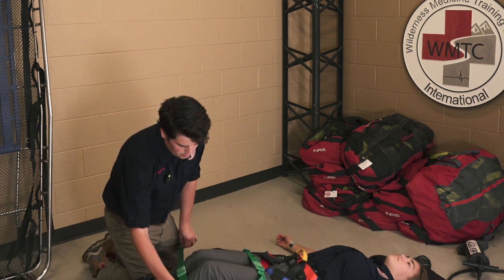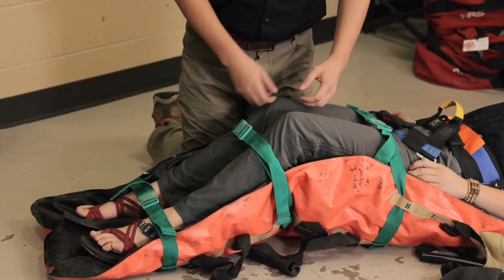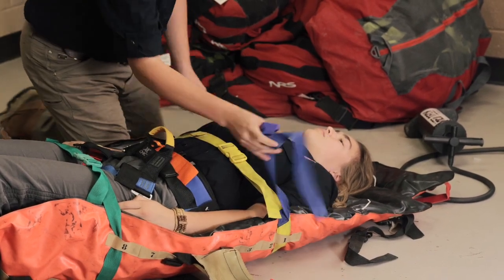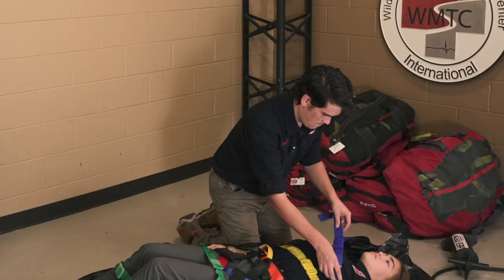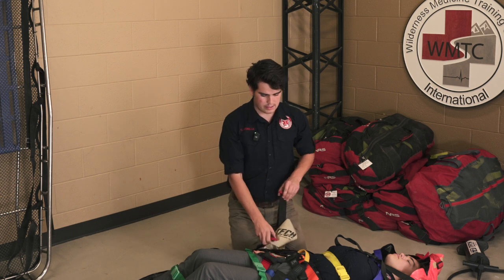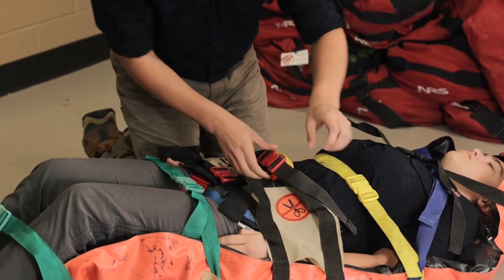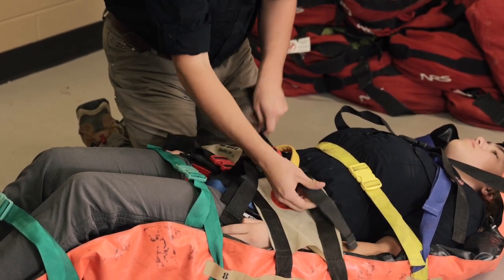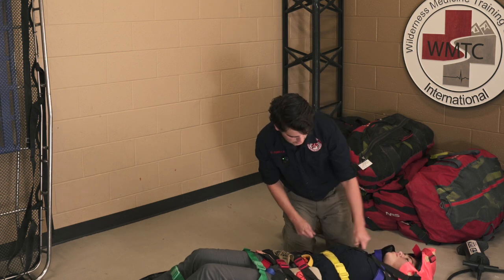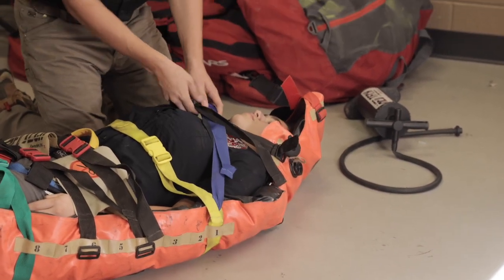One consideration: you don't want any straps going over the patient's joints, particularly the knees. If the straps are going over the patient's knees, you can cross them instead. We have an additional pelvic binder here — it's not necessary if you already have the other one on, but I'll clip it in to get it out of the way. Keep the waist harness attachment point clear. Go through and tighten all the straps. Also be careful not to cover the patient's neck — if you're worried about that, you can take a carabiner and clip it down out of the way.